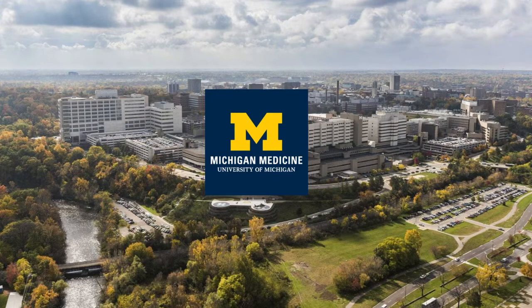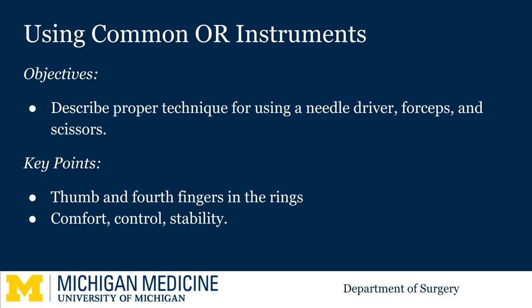Welcome to the University of Michigan MicroLearning for the Surgical Clerkship. Today we're going to be discussing how to use common OR instruments: the needle driver, forceps, and scissors.